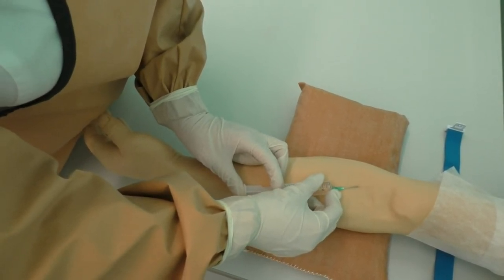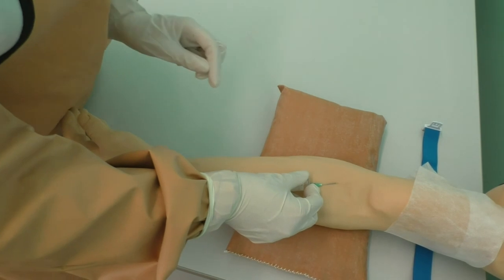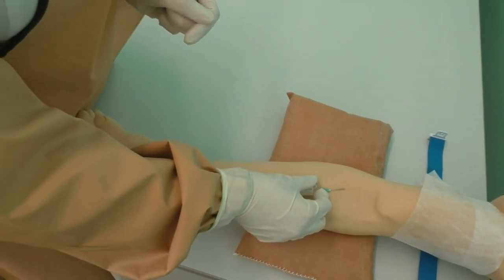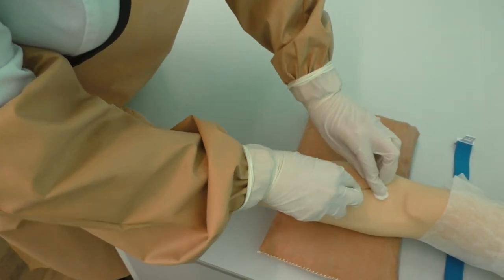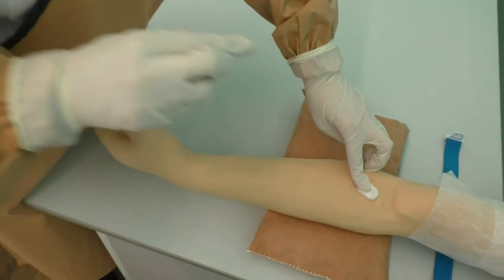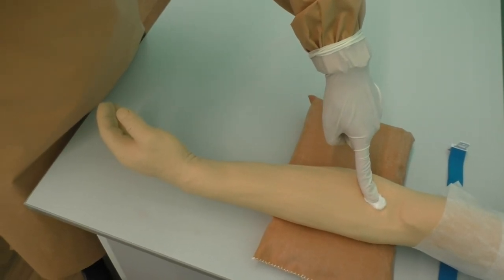Remove the needle from the patient's arm and press down on the vessel with a cotton wool ball. Tell your patient to apply pressure for 5 minutes and not to bend the arm. You can put a bandage on the injection site.